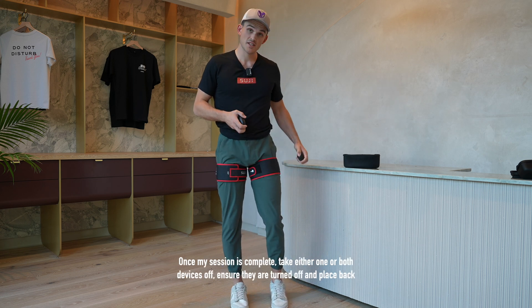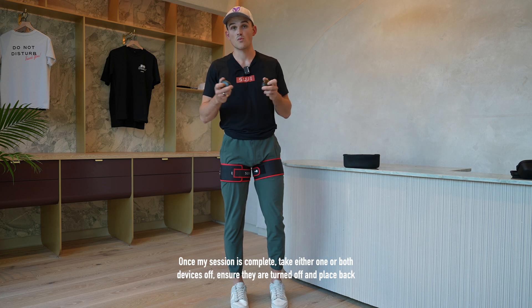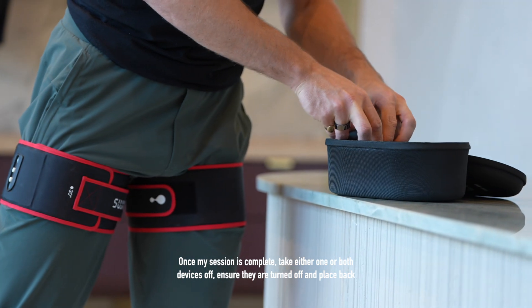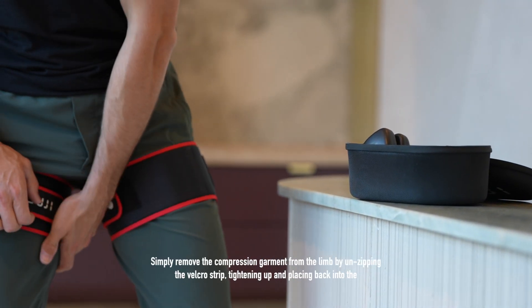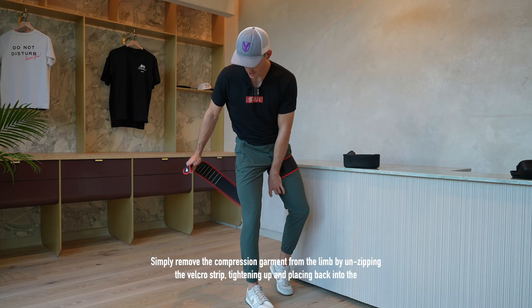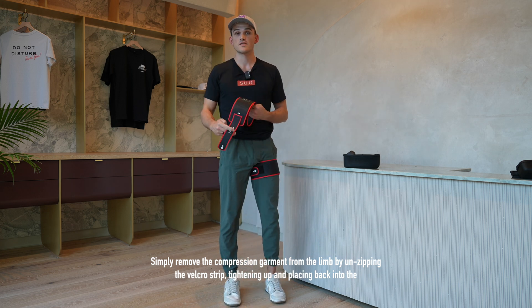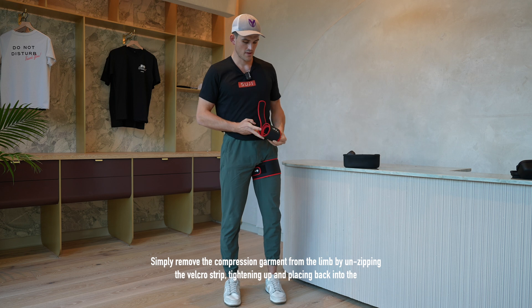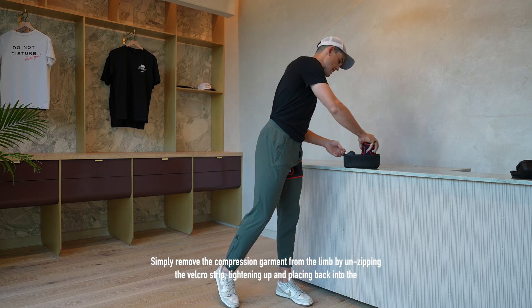Once my session is complete, take either one or both devices off, ensure they are turned off and placed back in the EVA carry case. Simply remove the compression garment from the limb by unzipping the Velcro strip, tightening up and placing back into the carry case.